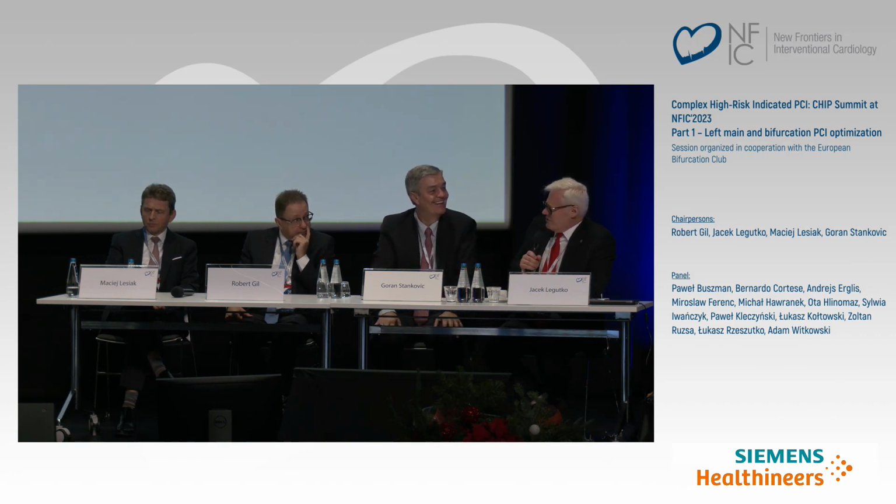It was great. However, there is always a compromise between better apposition of the stent in the left main and the risk of occlusion, the carina movement, and the occlusion of the circ, which was calcified in the ostium. Definitely there was a plaque. The strategy which you proposed, we have, to be honest, used in the past before the era of POT, where we used an oversized balloon with very low pressure. So maybe we can go back to this approach, which is a smart idea.